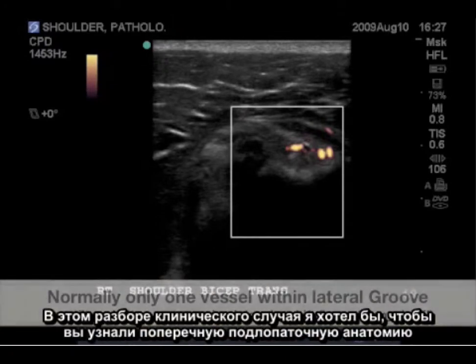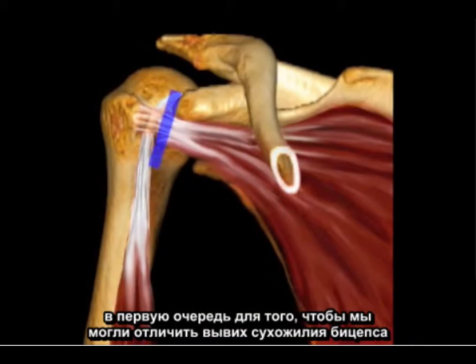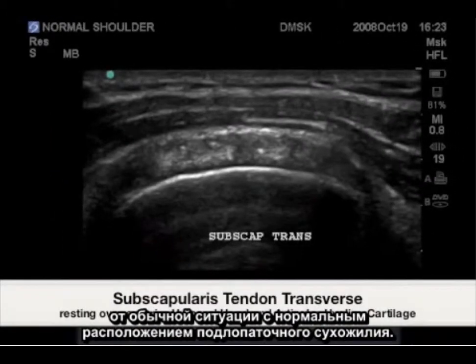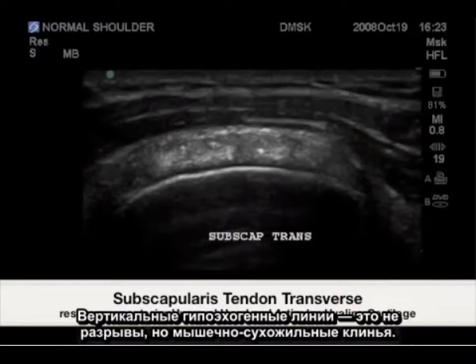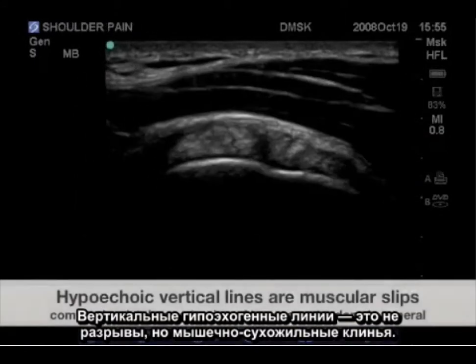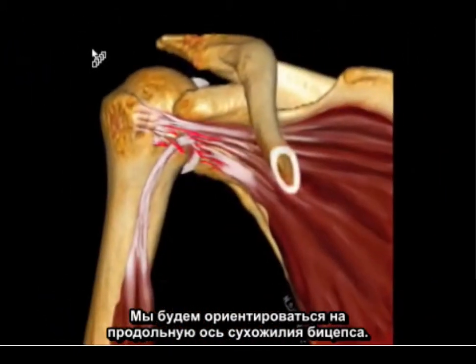In this case study, I would like you to recognize the transverse subscapularis anatomy primarily so that we can distinguish the dislocated bicep tendon from where a normally situated subscapularis tendon should be. The vertical hypoechoic lines are not tears, but musculotendinous slips. We will orient ourselves to the long axis of the biceps tendon.